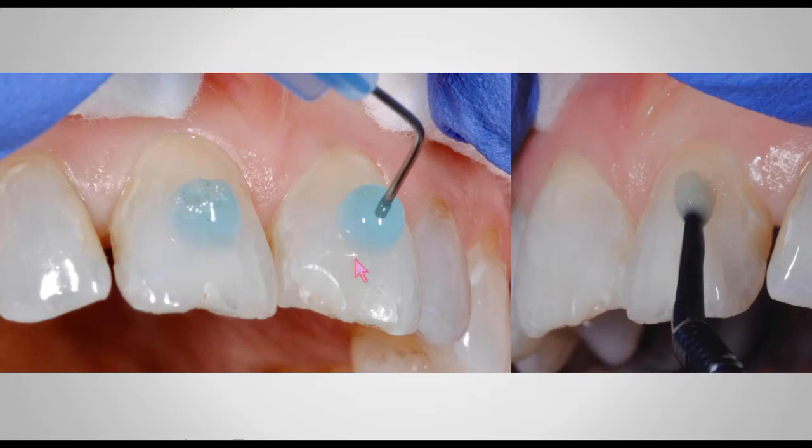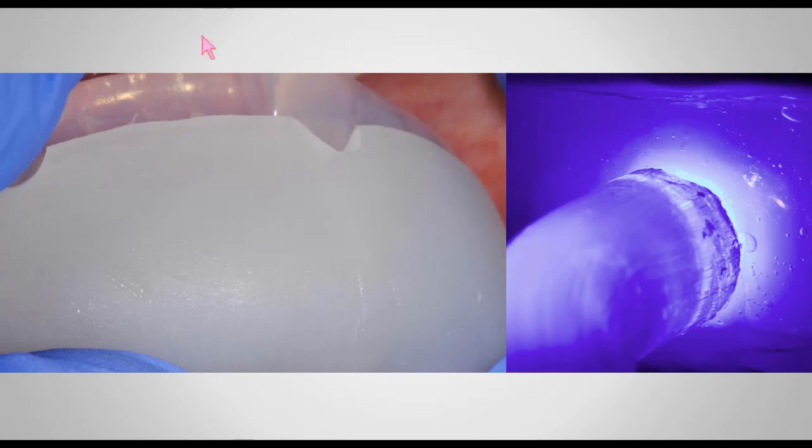Again, I'm going to wear these prototypes for a couple of weeks, so I'm going to spot etch for 15 seconds. Try always choosing an etchant that has a lot of body to it so it doesn't flow everywhere. I rinse after 15 seconds of etching. I rinse, I bone dry, and then I apply my adhesive all around the surface of the enamel. Remember, not only on the area that you spot etched, everywhere, so that you don't get any staining of the margins and you get very well sealed restorations. They're temporary restorations, but they're very well sealed.